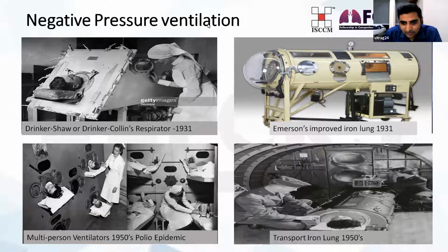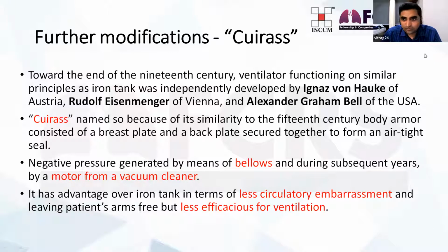And surprisingly, even in 1950, they were transporting patients on a ventilator. So this is the transport iron lung. This was quite cumbersome, as we can see from the picture.